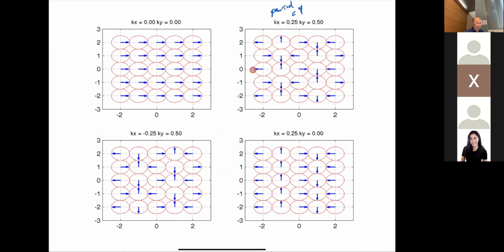So if you're trying to figure out the frequency, you can always see how long it takes, what the period is for repetition of the phase pattern, and then 1 over that gives you the spatial frequency, all right?